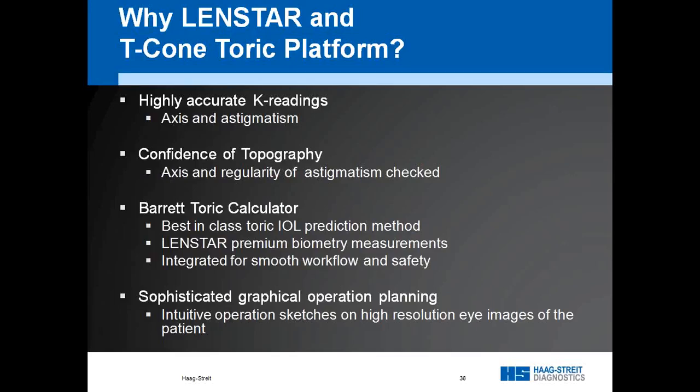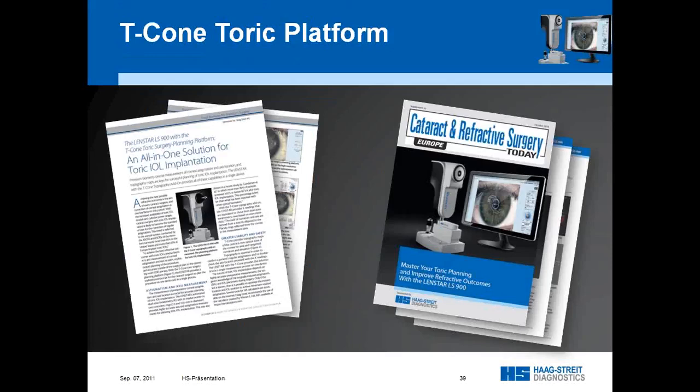And last but not least, you can plan your toric intervention on the real eye image of the patient. You can add anatomic landmarks. This all helps to double check your outcome.